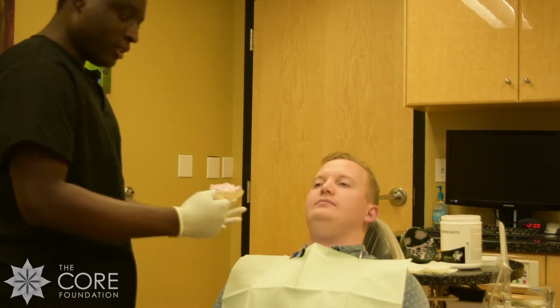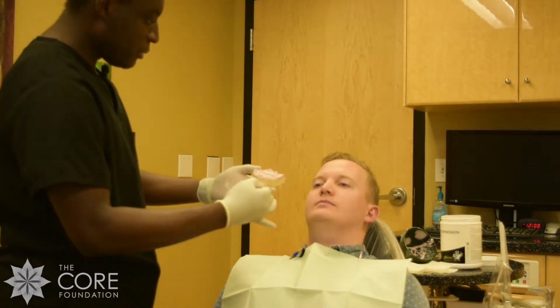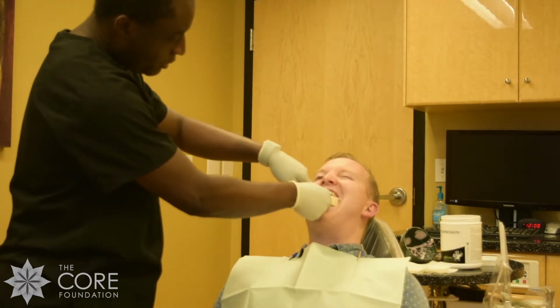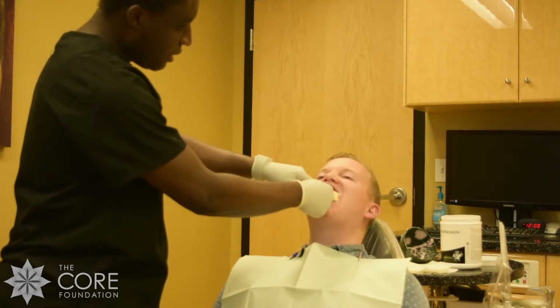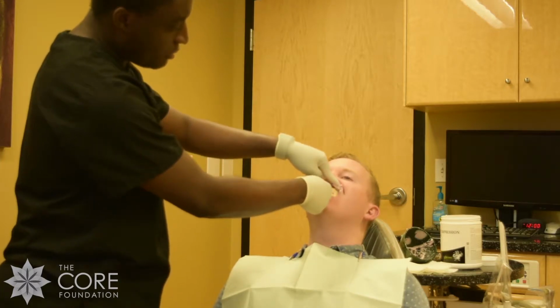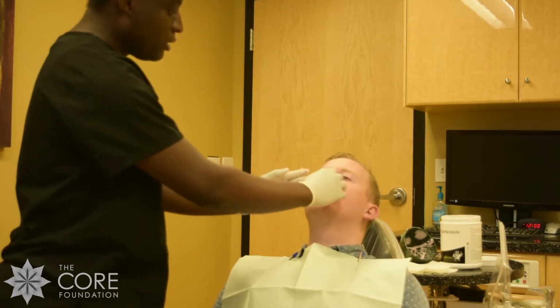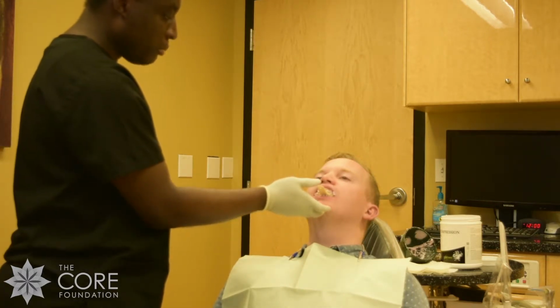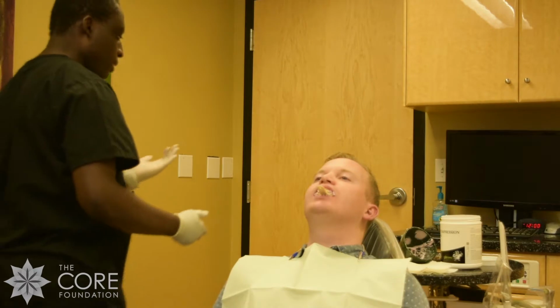When you're taking this, just stand right in front of the patient, have them open really wide. Okay, retract, place this in there, and then slowly bite down. Okay, and then as the patient is biting down, gently move the lips around to make sure you have the lips covering it, and then bite really hard. Okay.